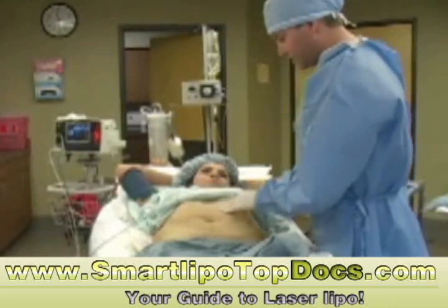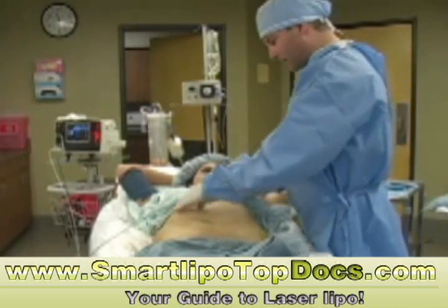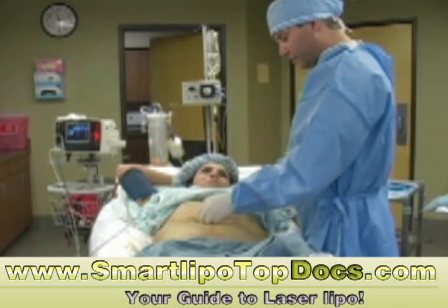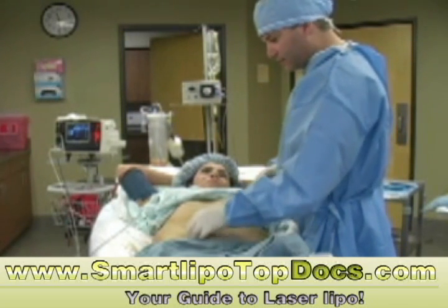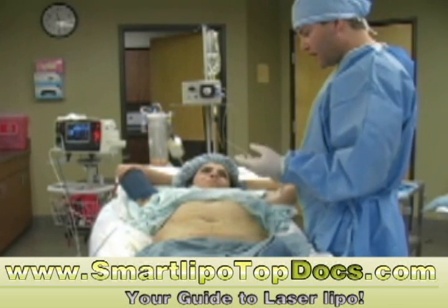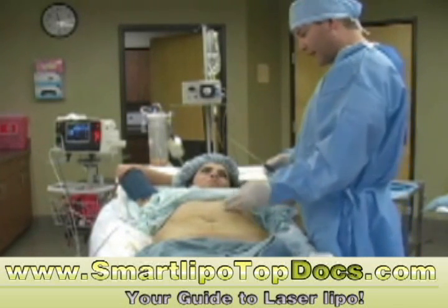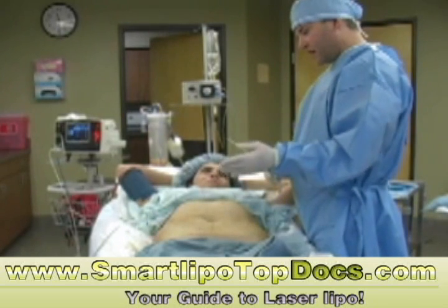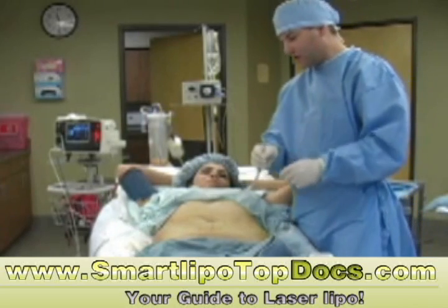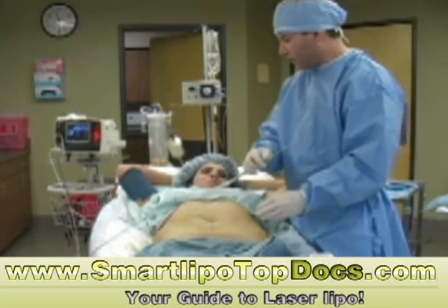Now to get at some of this top part of the fat, this is where we have to be even more careful if we want to get accurate results. We need to use very small instruments. You can see the size of this instrument — it's one of the smallest that I use. But it ensures that going through tight spaces like the upper abdomen, we're not creating irregularities underneath the skin. Only by using small instruments can you really guarantee your patients the best results.